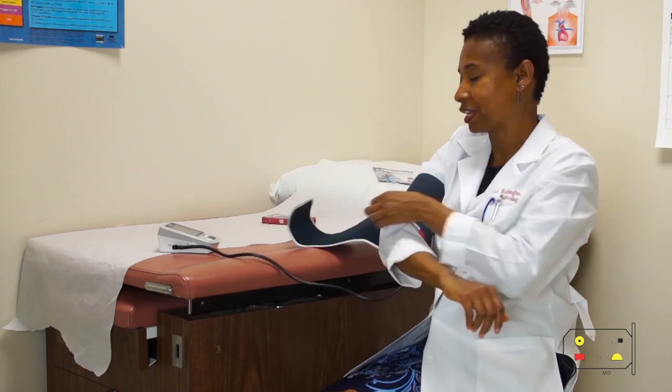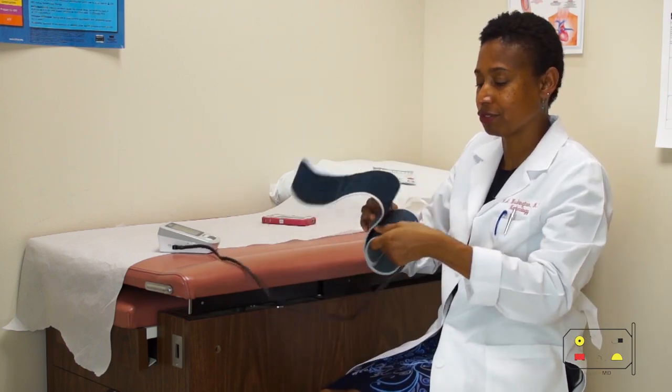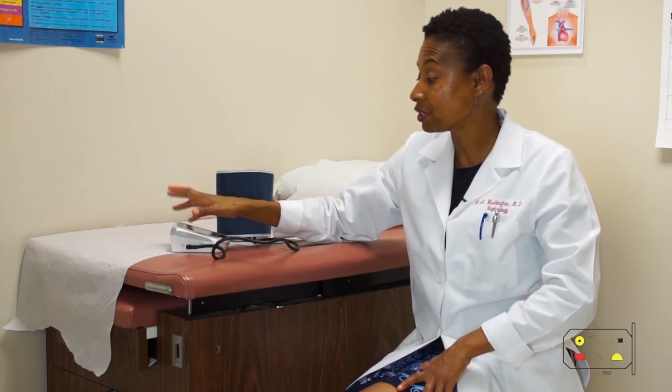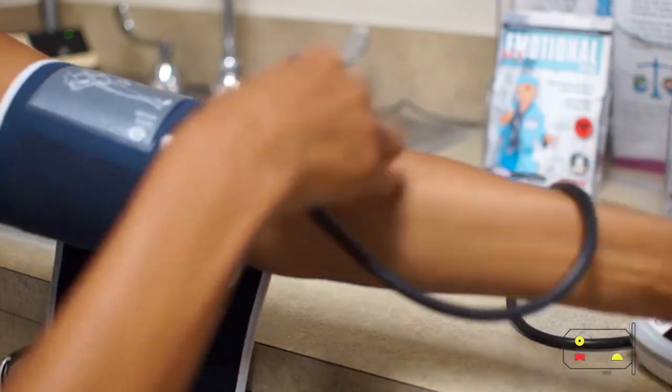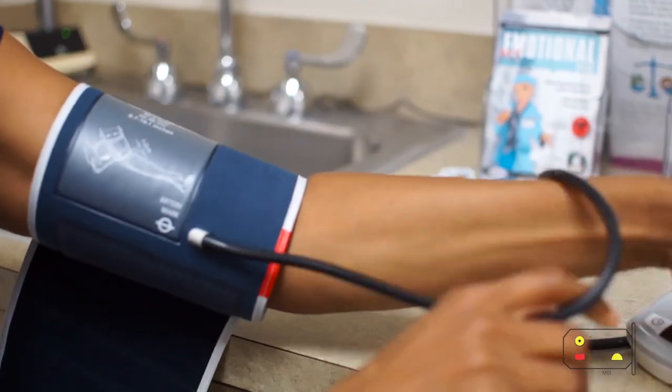So that's my spiel on blood pressure monitors. Again, a digital monitor is easiest to use for your parents or grandparents, not a wrist monitor. For those of you who buy a wrist monitor, you may want to take it with you to your doctor's office and see if it compares with the digital monitor or a mercury monitor that he may have on the wall. Again, measure your blood pressure. Try to do it the same time every day.